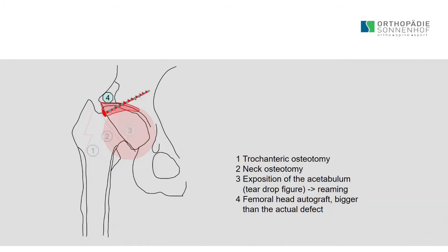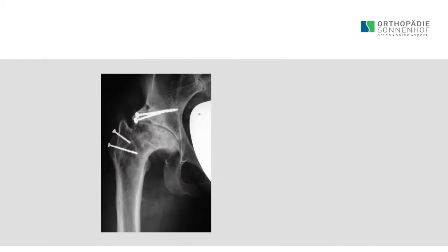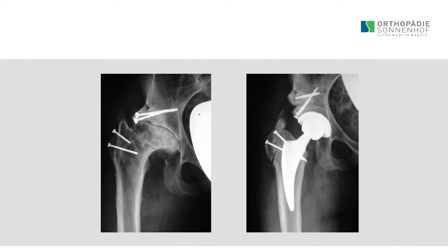And then you know how much bony deficit you have, and you can use the femoral head as an autologous graft. You put in a bigger piece than what fills the defect, so the defect should be overstuffed, and then you can do the reaming up to the size you had before, and then you can fix, or you already did fix, your autograft with 2 Kirschner wires or even with 2 screws. At the beginning, you can do the definitive fixation with 2 screws after the reaming. We usually use 3.5 or 5 millimeter screws. And this is what we achieved in this patient.